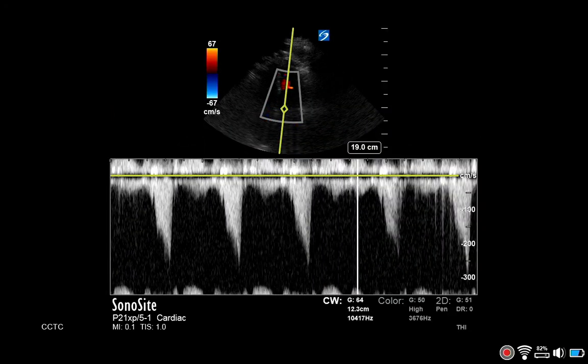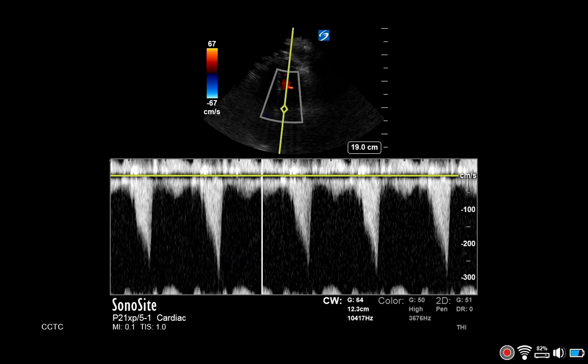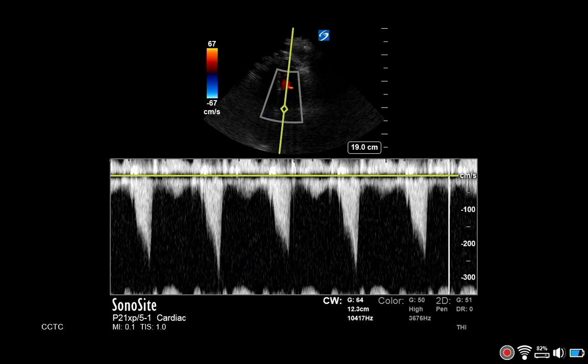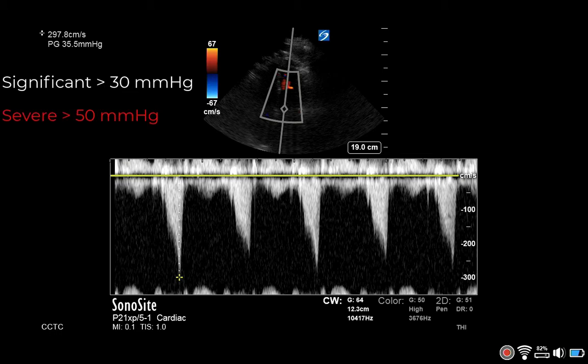If there is LVOT obstruction present, you will see a dagger-shaped waveform with a late systolic peak, as is seen below. Freeze the image and measure the peak systolic velocity. The LVOT gradient is equal to four times the peak systolic velocity squared. A significant gradient is greater than 30 mmHg, and severe is greater than 50.